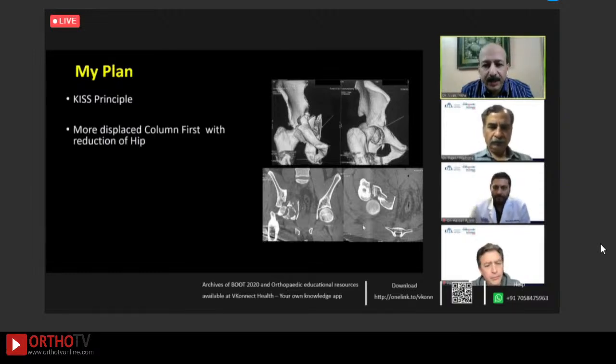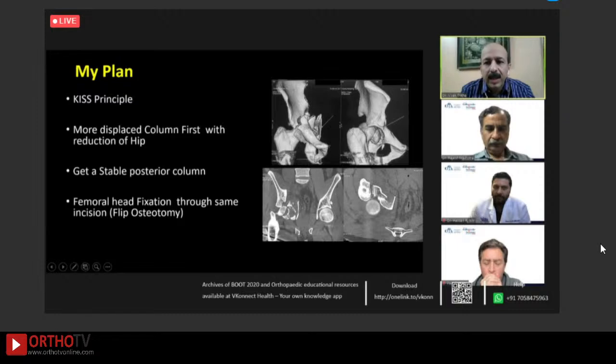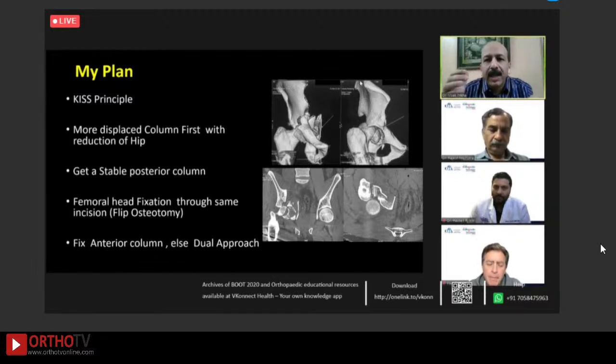Because it was a posterior dislocation of the hip, along with the more displaced column, I thought I should reduce it as early as possible. So the first thing I thought I would do was reduction of the hip and tackling the most displaced column. Once I get a stabilized posterior column, then I can fix the femoral head through the same exposure, if required, as I said, with a flip osteotomy. And if my reduction of the anterior column is anatomical, then I might put a screw in while I'm seeing it.